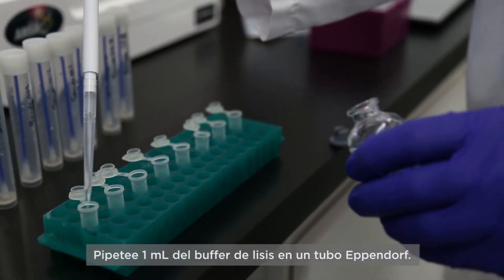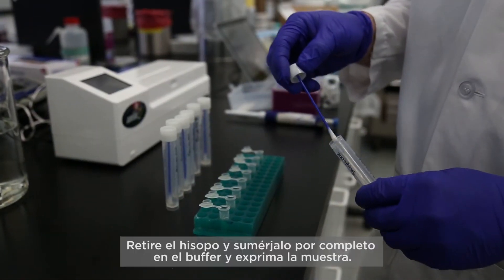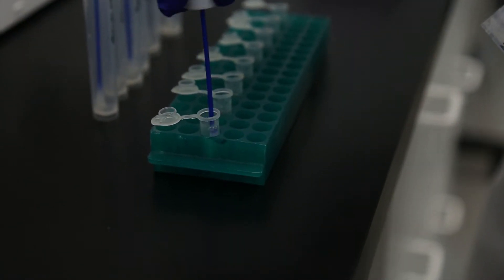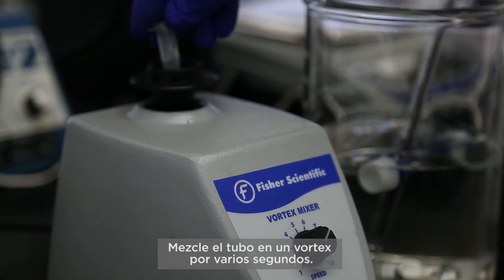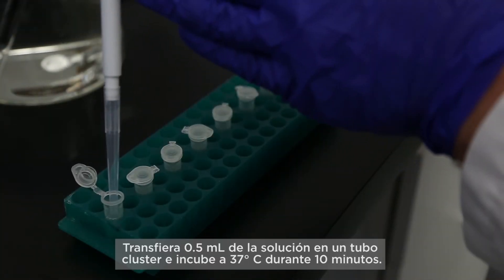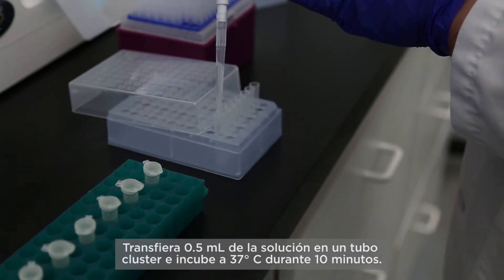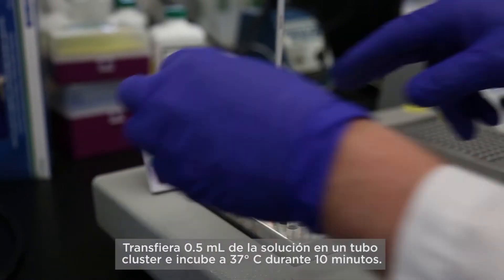Pipet 1 milliliter of the lysis buffer into an Eppendorf tube. Remove the swab and dip it completely into the buffer and express the sample. Vortex the tube for several seconds. Transfer 1/2 milliliter of the solution to a cluster tube and incubate at 37 degrees for 10 minutes.